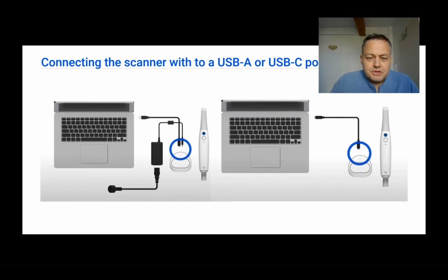Okay, after you have placed the tip on the scanner, now it's time to connect the scanner to the computer. To connect the scanner to the computer, we'll need to connect it to either a USB-A or USB-C port. USB-A ports are not delivering enough power, or power at all, to the scanner or to the scanner base so that it can work properly.